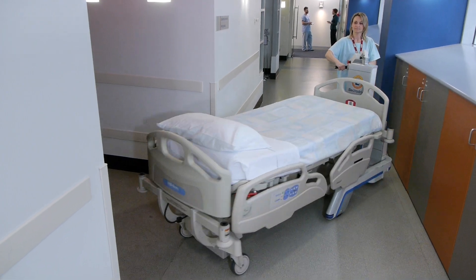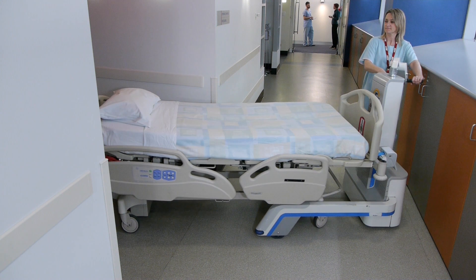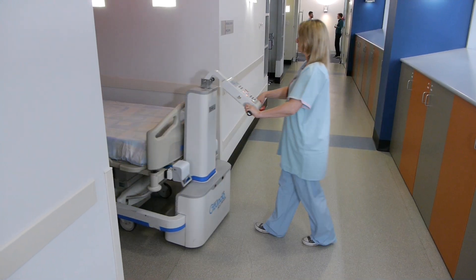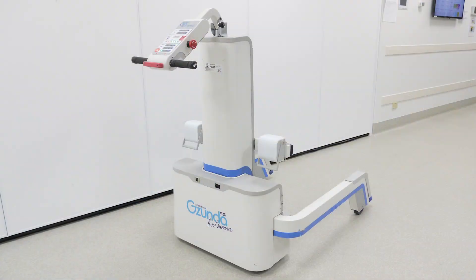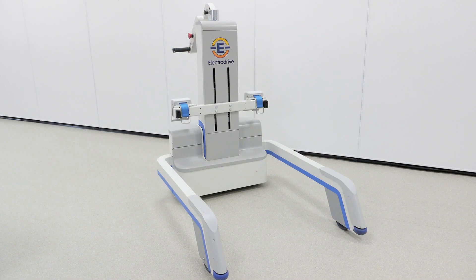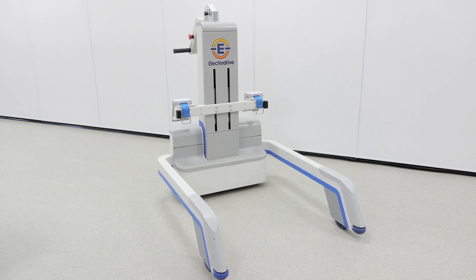Thanks so much for joining the presentation. We really hope you feel the difference in your work day as the effort of moving heavy beds is carried by the Gezunda. Thanks again and feel free to contact us if you have any queries.